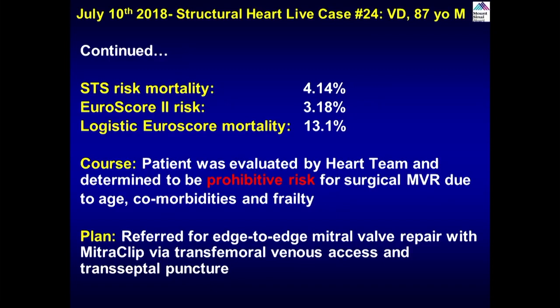And they actually don't even have any arterial line except the anesthesia. Dr. Stone is there. They just keep an A line, but no arterial puncture in the groin. I mean, that's a great thing.